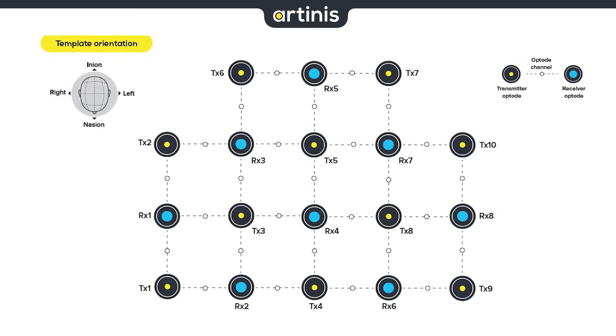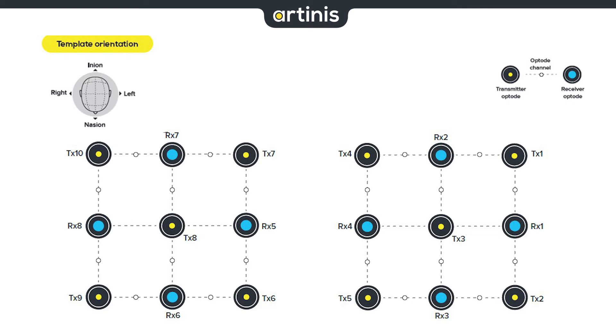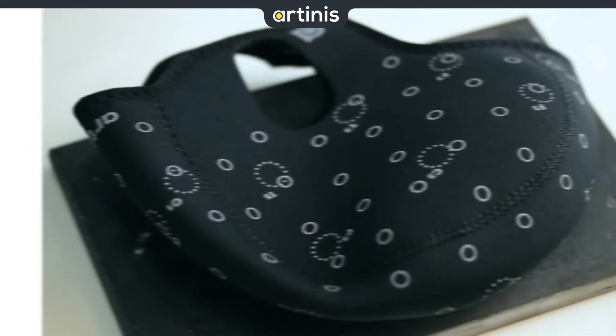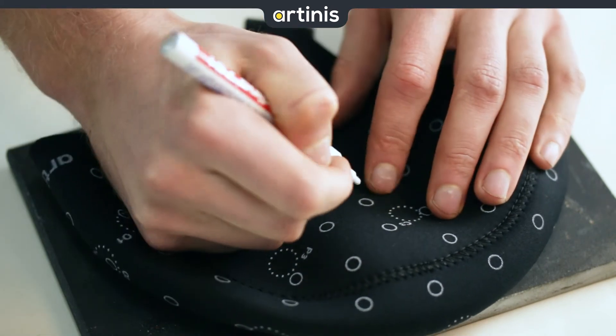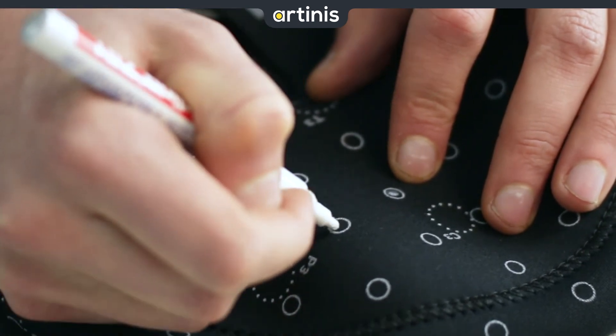Instead, we can also create multiple subtemplates in one opto template — for example, 2x12 channels, or 2x4 and 2x5 channels. The headcaps come with a pre-printed outline of the 30mm indications. For Artinis templates you can use these, but you are of course free to design and mark your own template.